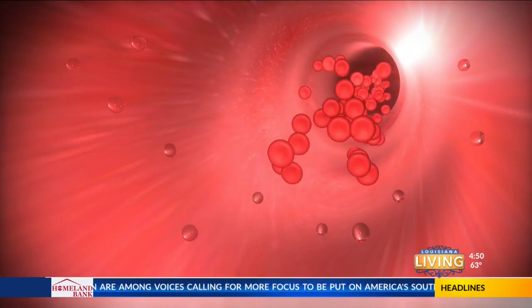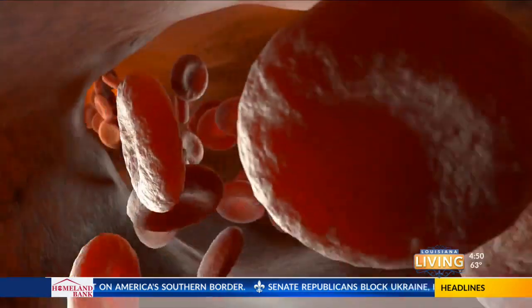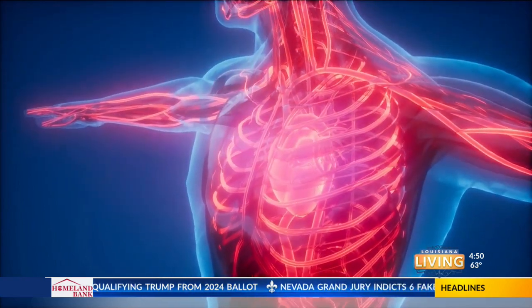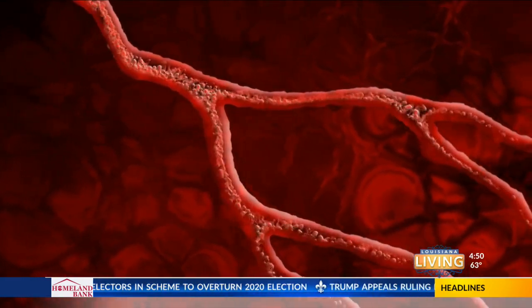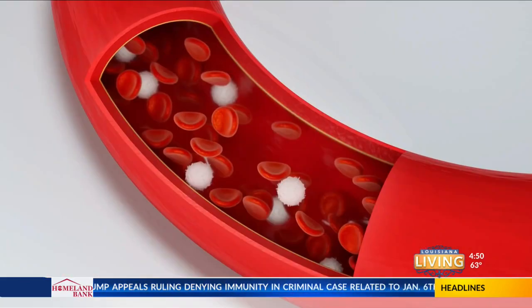So what it is, like it says, is blood flow restriction training. This is like a blood pressure cuff specifically made for blood flow restriction training. It will blow up to occlude the venous return and restrict the arterial flow. It doesn't completely occlude it — it will gauge all of that through this device and automatically does all that to be safe.